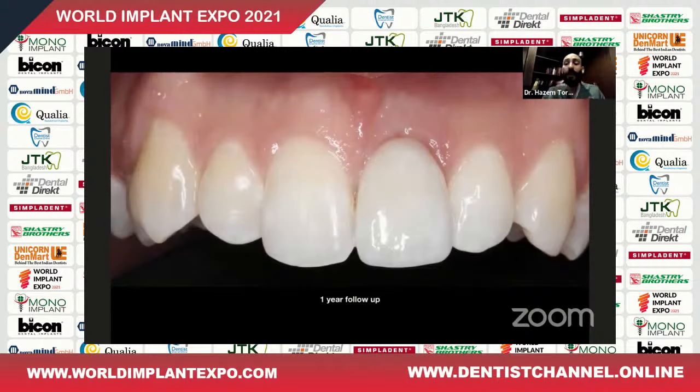Now, after 1 year, the patient disappeared and came back after 1 year. And I told him, where have you been? I needed to see you. And then I looked at the case, and now there is a problem because the tissues are inflamed. It's not normal. We need to do something about that. So I informed him that we will have to interfere and correct this situation or enhance this situation in order for him to have a restoration that will function with him through his lifetime.